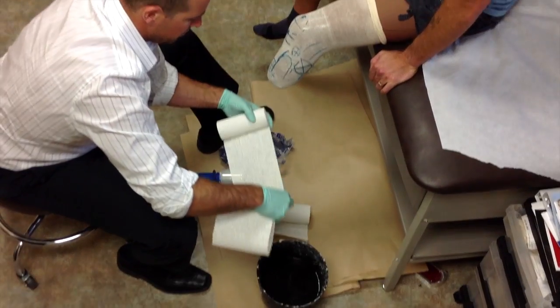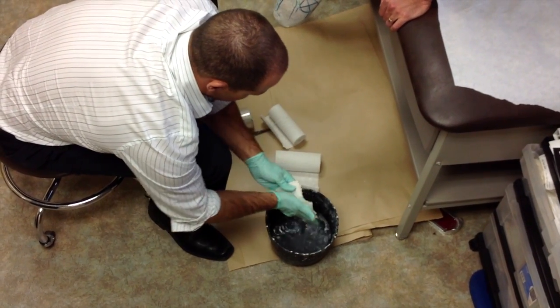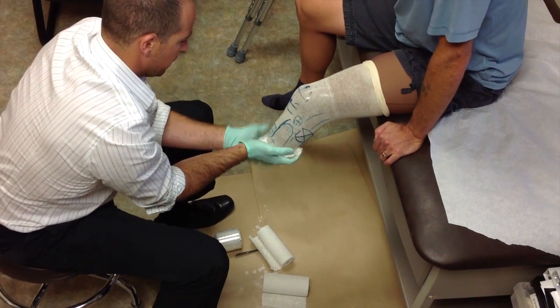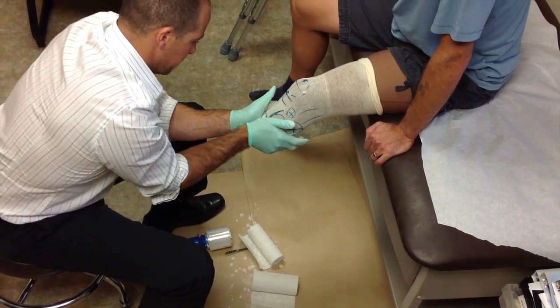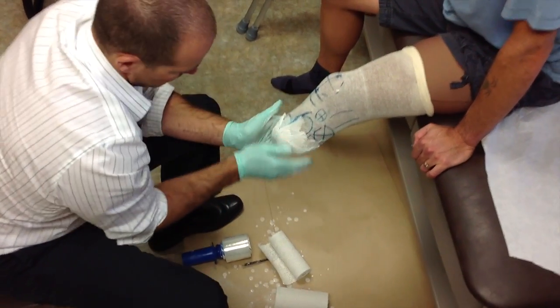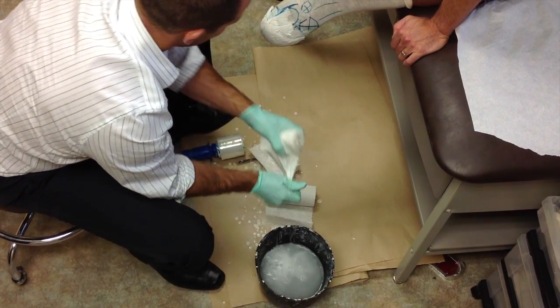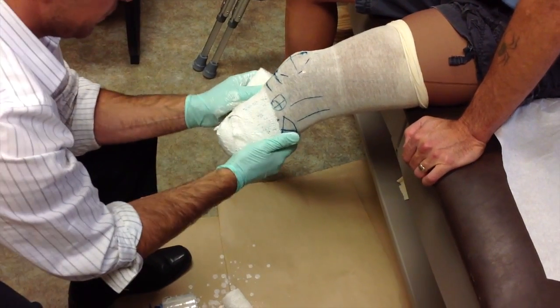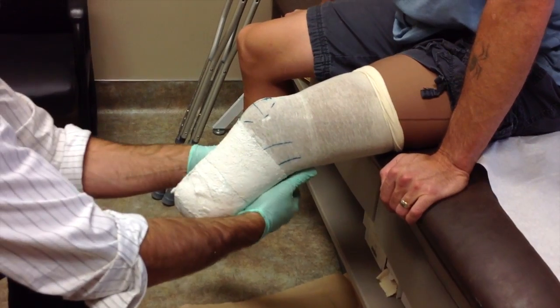Next, the practitioner will take some of this material called plaster of Paris — this is the actual casting material. When dunking it in water, it sets off a chemical reaction that will harden the material after about five minutes, so you've got about a three to five minute working time. The practitioner has taken an entire roll of plaster and is wrapping it circumferentially all the way around the limb to create a nice thin layer of plaster of Paris, with which they can then start to apply pressure in very unique and specific ways.